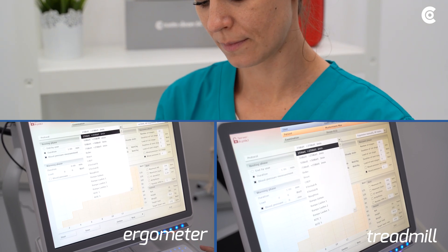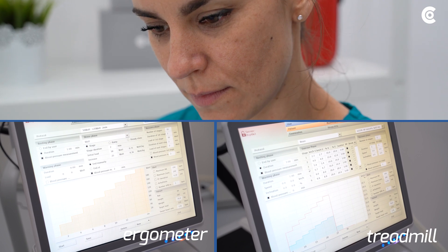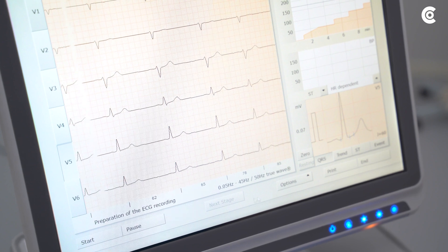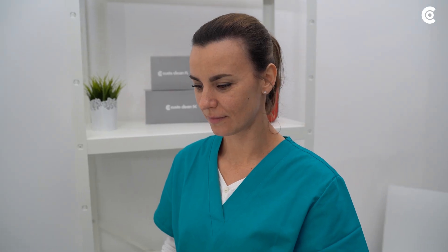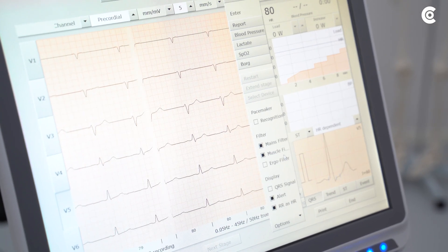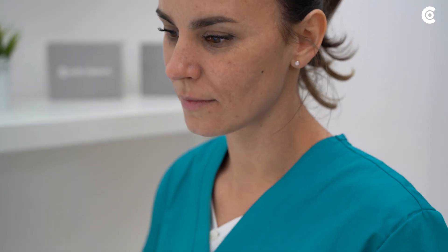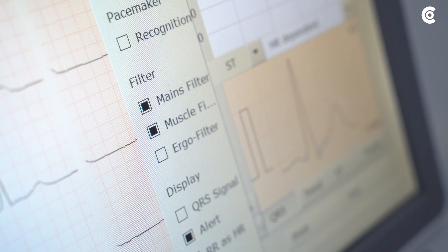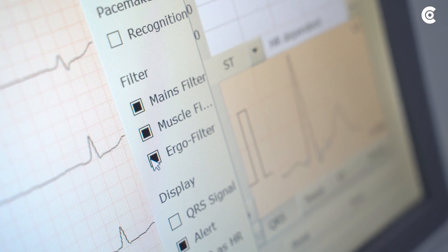Then select a protocol for the measurement. You can modify the settings for resting, warming up, stress and recovery phase individually. Before starting, check the ECG via the software and correct the electrode position if necessary. Custo Med recommends using the mains and muscle filter to prevent disturbances in the ECG signal. If it is a stress test with high load, you can additionally activate the ergo filter to ensure a more stable ECG signal.